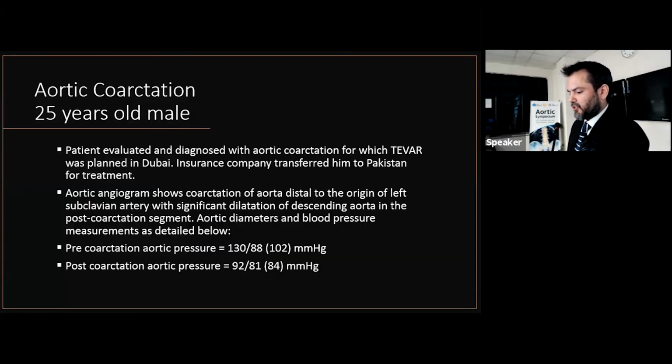Another patient, much younger this time, he flew in from Dubai because the insurance company thought it was cheaper to get it done in Pakistan. They wanted to put a TEVAR in Dubai. I don't think the TEVAR has sufficient radial force to actually expand a coarctation. I think the TEVAR would have failed in his case.